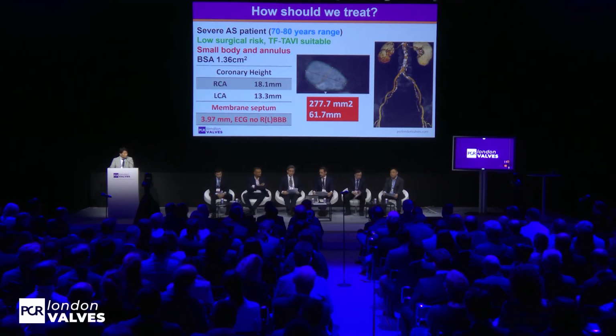The other thing that I would consider is, if it's a pericardial valve, I worry about sinus sequestration because of the small STJ and also future coronary access. So probably I would choose between stabilizing good hemodynamics without jeopardizing the overall anatomy, because not just the annulus, the STJ and sinus are all very small. Yeah, that is also important to consider for lifetime management for this kind of patient.